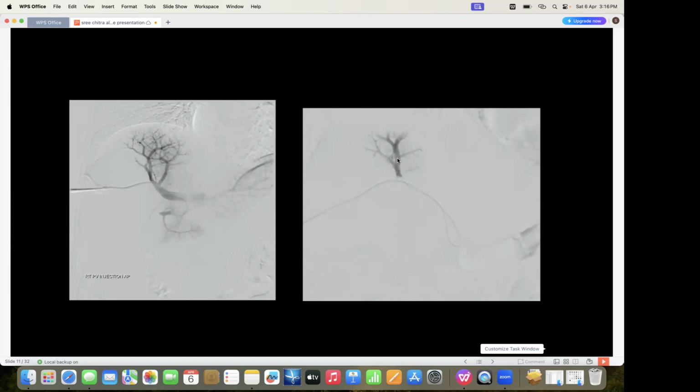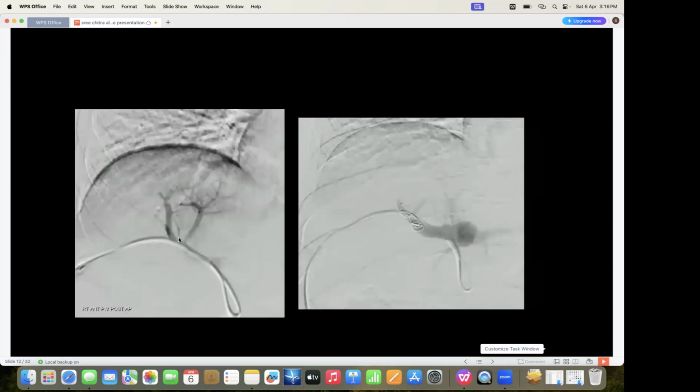We took an injection here. For each branch, the embolizing agent of choice in portal vein embolization is usually glue and lipiodol, because while embolizing the segment 5, 6, 7, 8 branches, there will be a lot of consumption of PVA particles, while glue and lipiodol can complete the procedure fast and effectively, with lesser cost as well.